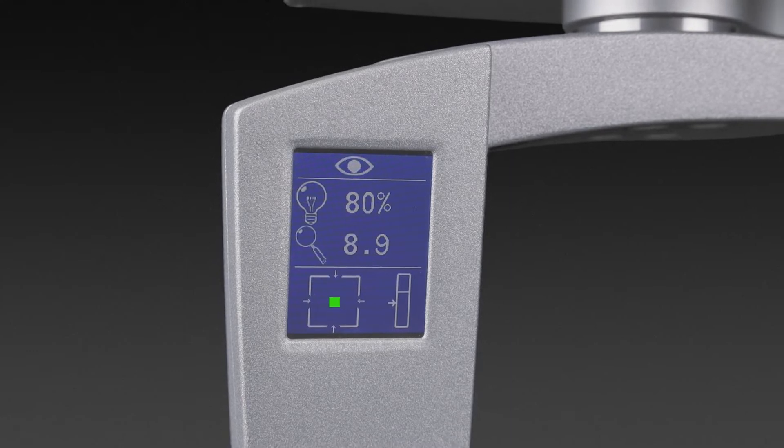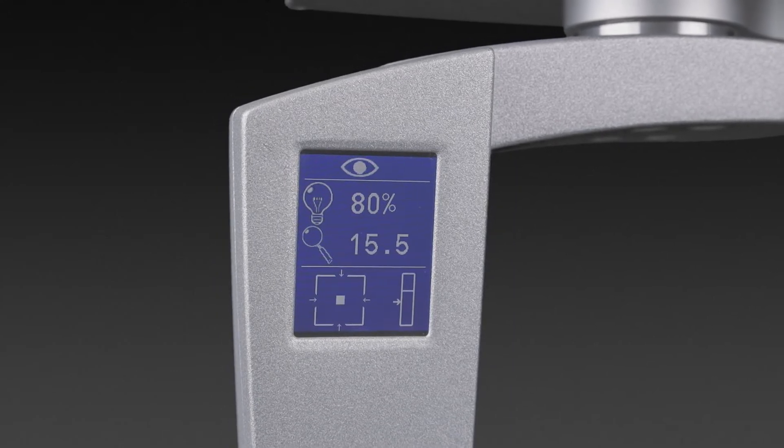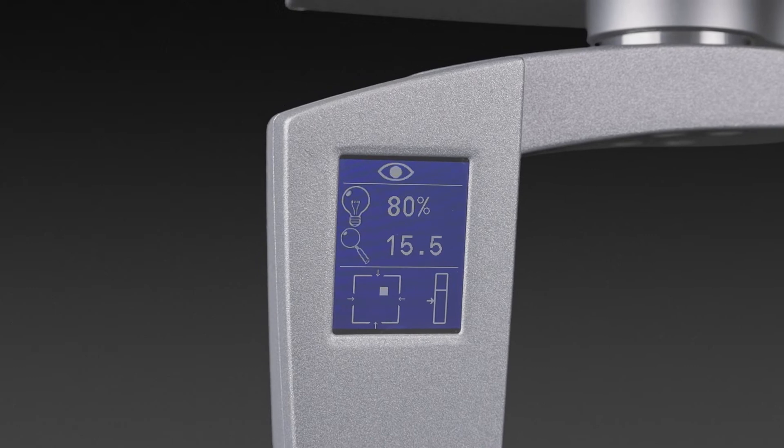At a glance, you find information on the position of focus, zoom, and XY coupling, as well as the level of illumination.